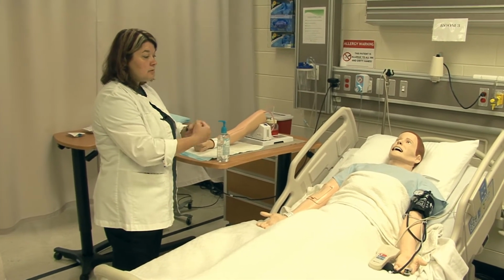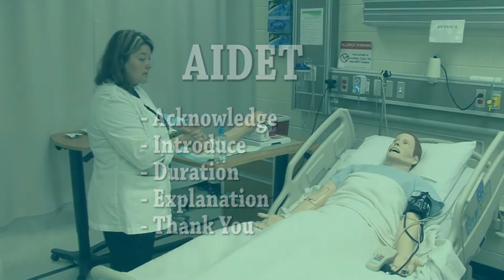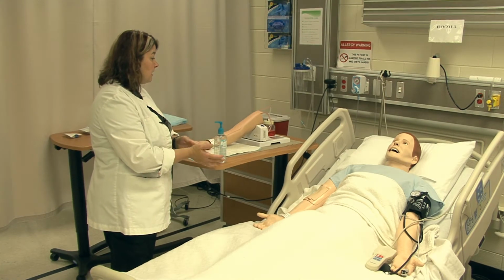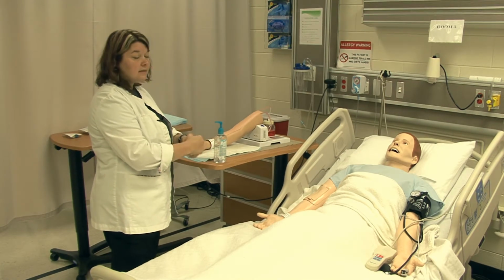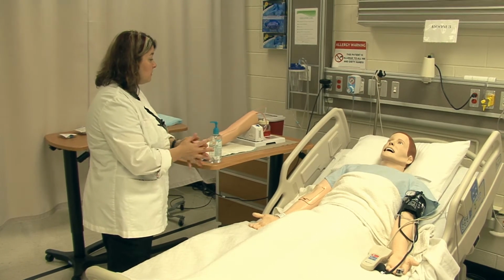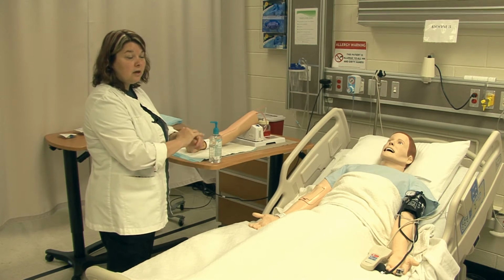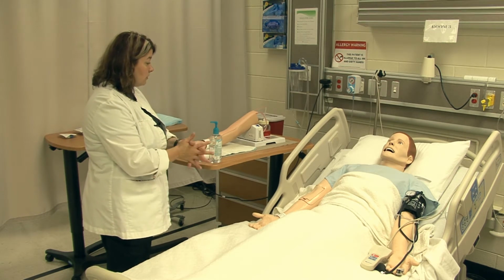As I'm talking to Mr. Smith, I'm going to perform AIDET, which would be to acknowledge the patient as I've done. I'm also going to ask him about his allergies. Mr. Smith, do you have any allergies, sir? He says that he does not. I'm going to introduce myself. My name is Heather. I'm going to be your nurse today, and then I'm going to go through and explain the duration and the explanation of the procedure that we're going to be doing.